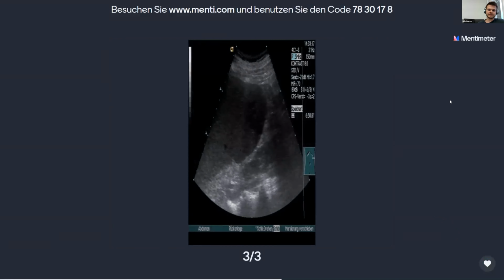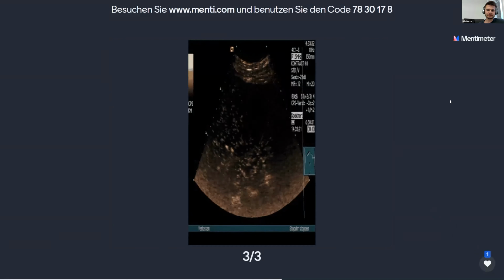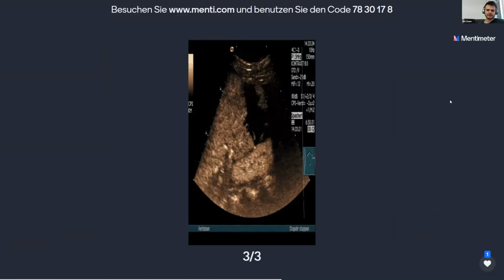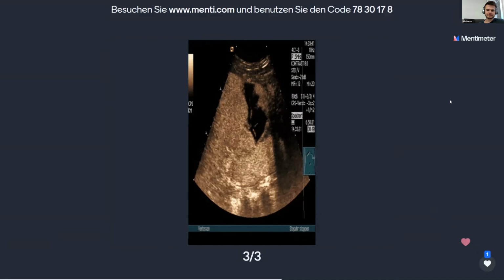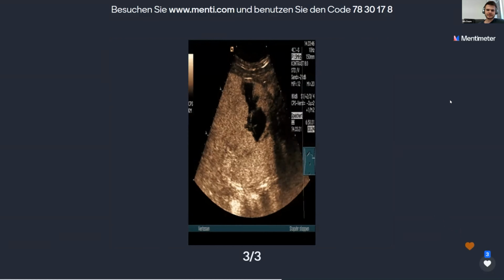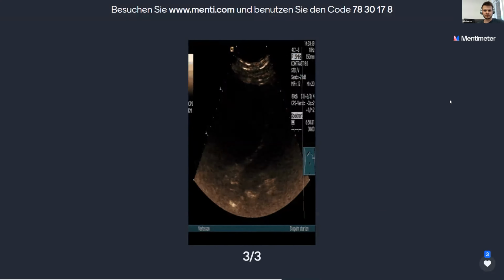And we also have the source here. Maybe you can also see a pathology here. So we will have a look one more time.